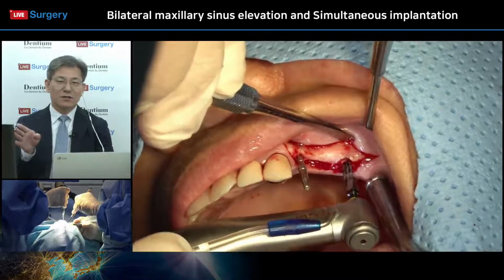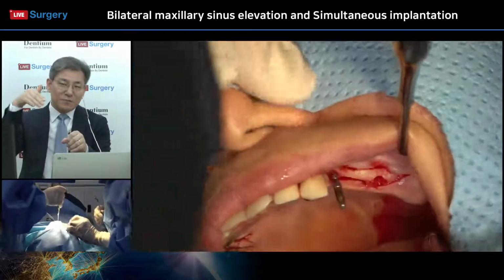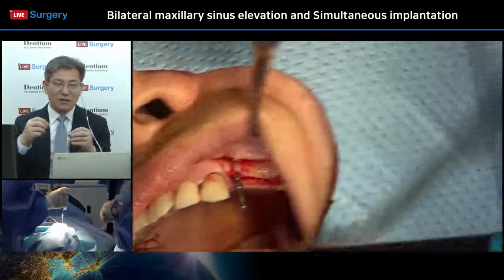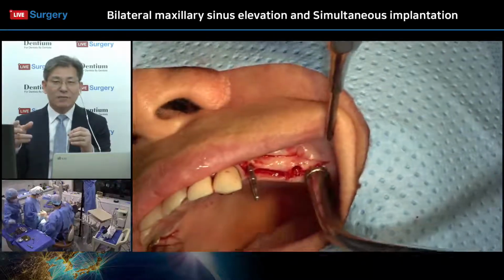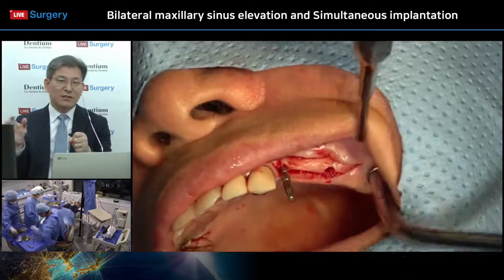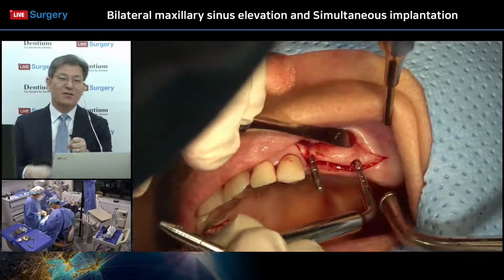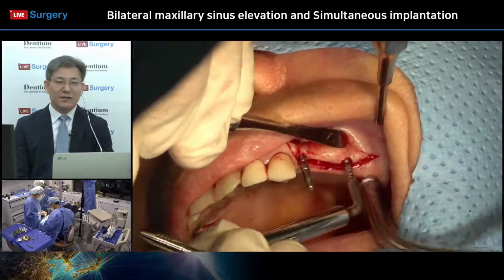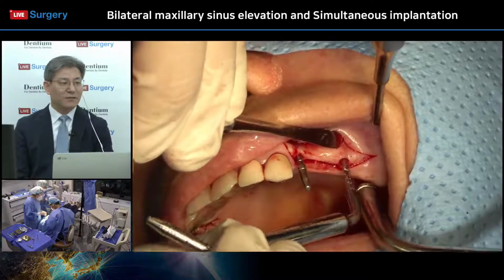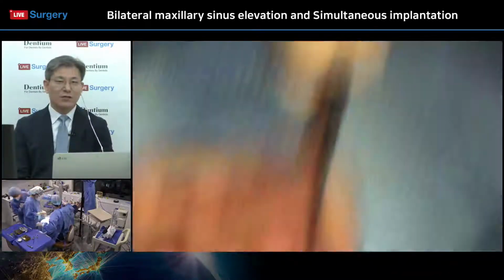So first, can you see, make an indentation using a high speed bur and the ridge split blade with malleting. Make an indentation, and after that, ridge spreader drills, right? From smaller to larger, with insertion and reverse action because this spreader drill doesn't have any blade. And after that, finally, the final osteotomy drill was used, right?